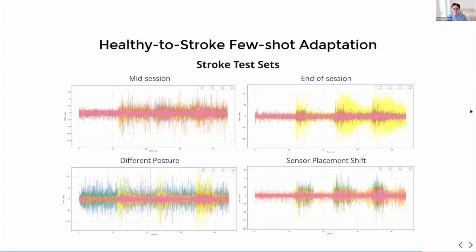And the data set we have is also a slightly out-of-distribution data set, because we want to test more realistic use cases under fatigue, under different postures, and under sensor placement shift. So these are the visuals I showed you earlier. These are actually our stroke test set. It's not enough to be accurate in this one fixed position.